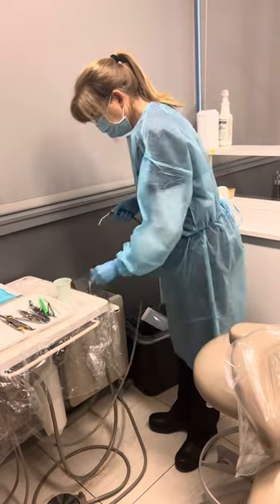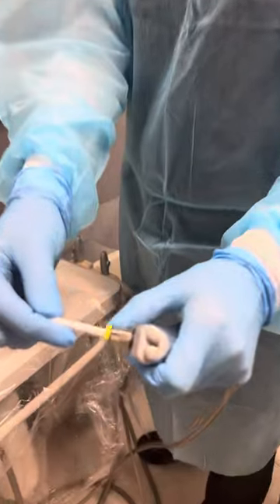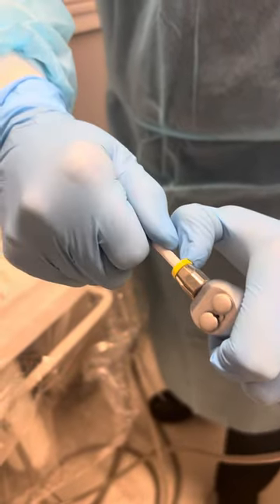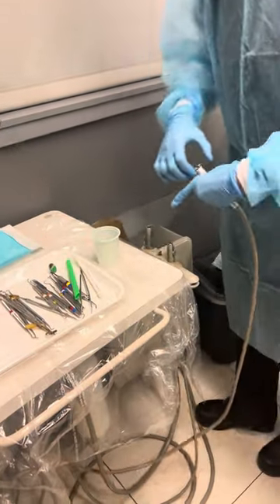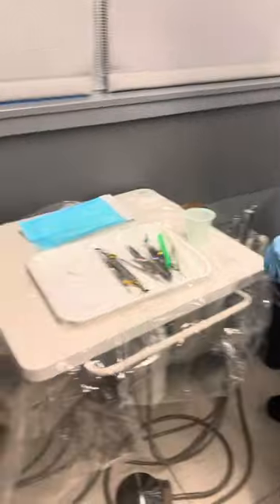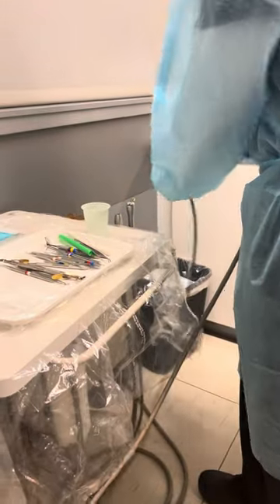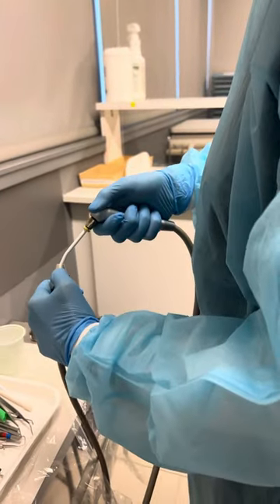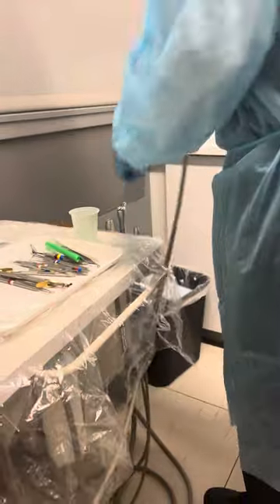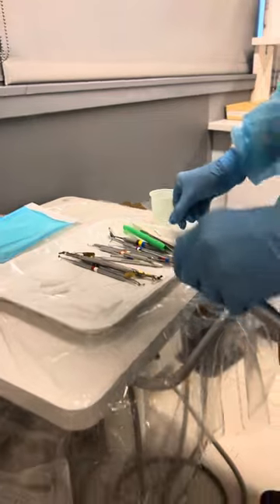That side is done and she's going to take that tip off. When you take it off you have to pull back the yellow ring and then pull out — never twist those. Now we're coming to the other side. She's going to run the air-water syringe for 20 seconds — you can do it in either suction or in a cup, it doesn't matter. Then she takes that tip off: pull back and pull.